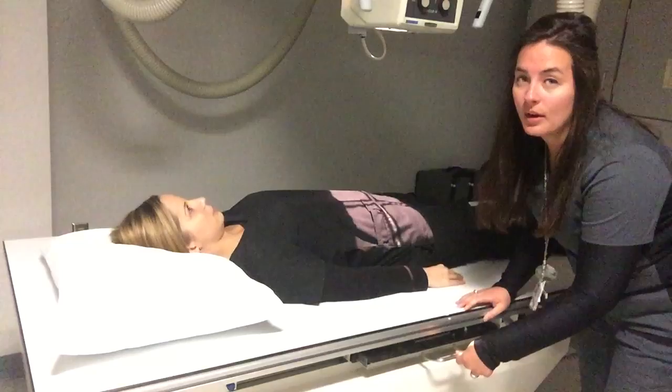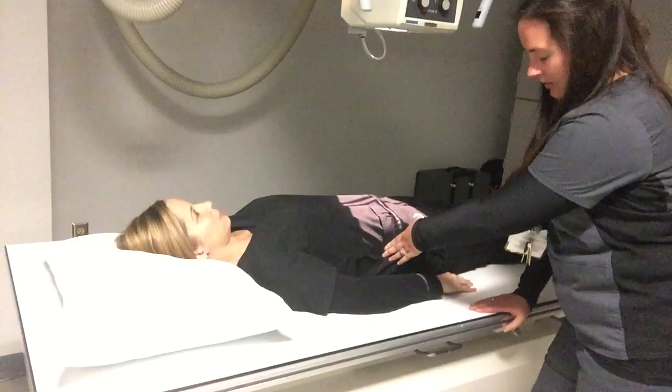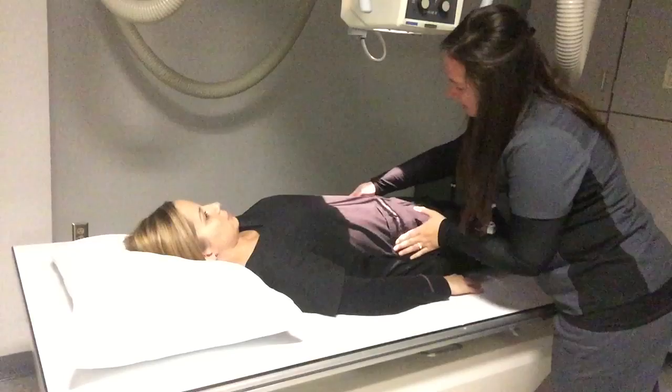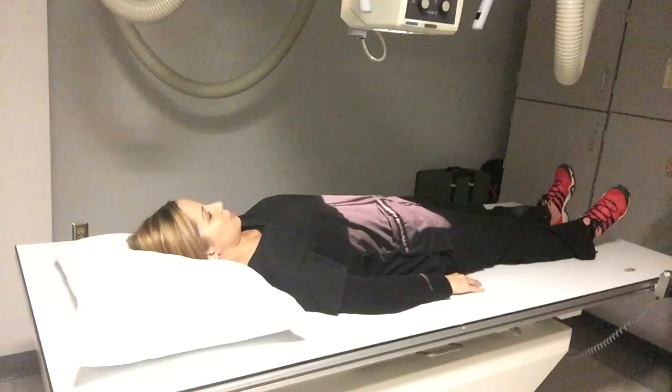But for this one, we'll be doing supine. So essentially, I'm just going to look for crest, find it, and I'm going to come over to MSP. I'm not going to be able to shield — we are looking in the area where I would be able to shield, so I won't be able to do that. And make sure my patient's nice and straight on the table so that MSP runs right along with my collimated light.